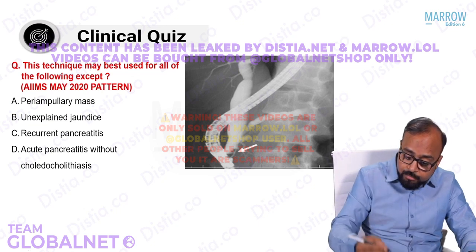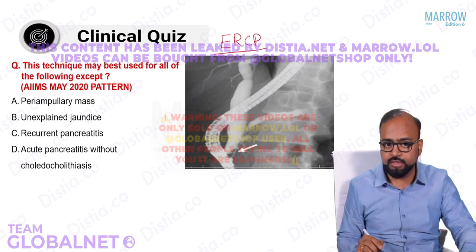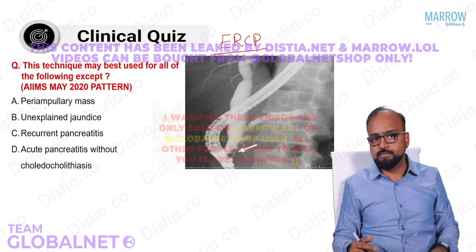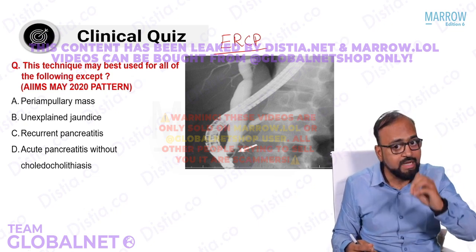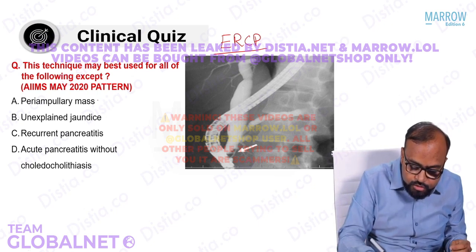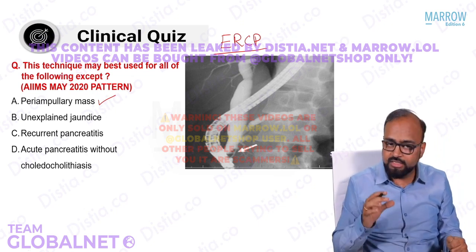This technique may be best used for all of the following except, what is this technique? It is ERCP. We have studied it is the gold standard for biliary tree evaluation, isn't it? Now see, can it be used for a periampullary mass? Remember, it can be used for any condition which affects the biliary tree in the form of obstruction or dilatation of the biliary tree. Can a periampullary mass cause biliary obstruction? Yes, pancreatic duct obstruction, biliary obstruction, double duct sign we have seen in periampullary CA head of pancreas.